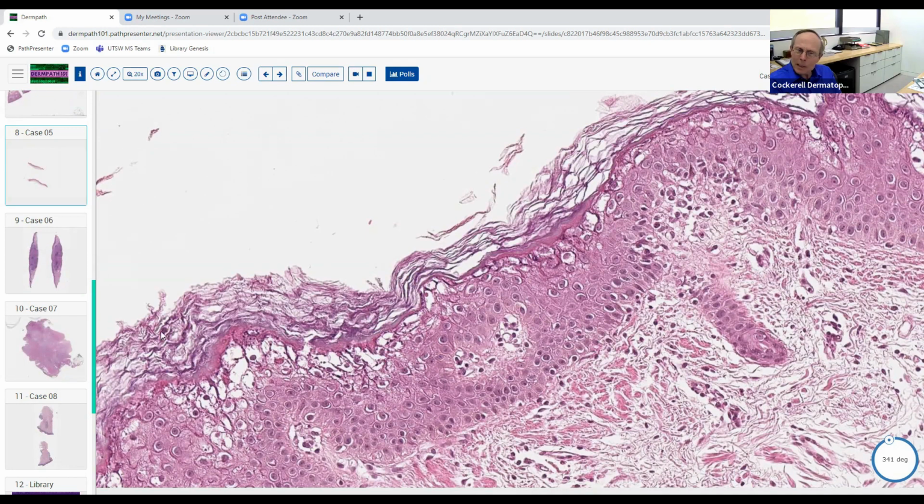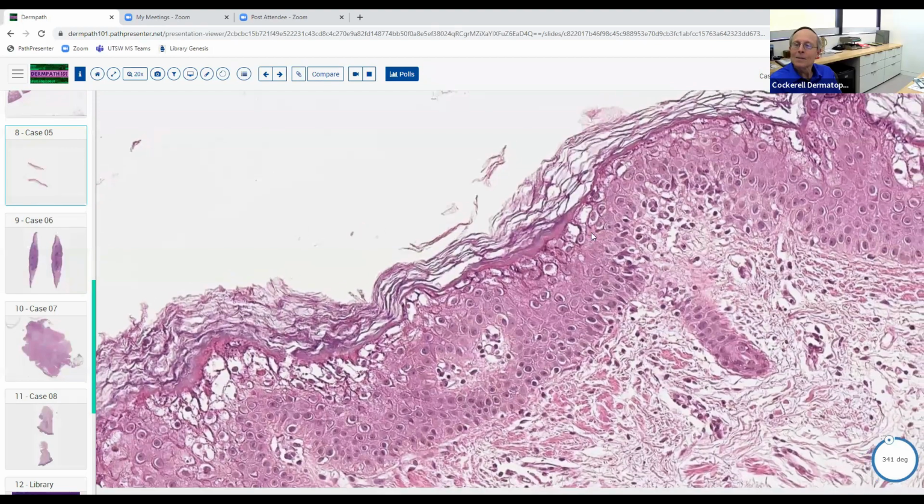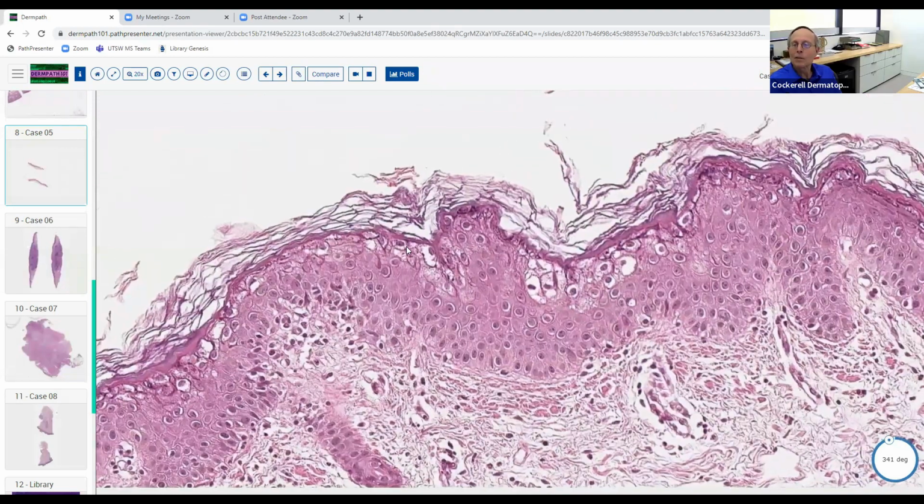It's kind of basket weave, but it's hyperkeratotic, and it's got this abnormal basophilic granular character, which you can imagine would be kind of verrucous and crusty and scaly. So this is a good example of epidermolytic hyperkeratosis. Okay, so make sure you fix this in your mind. This is a nice example of this pattern.